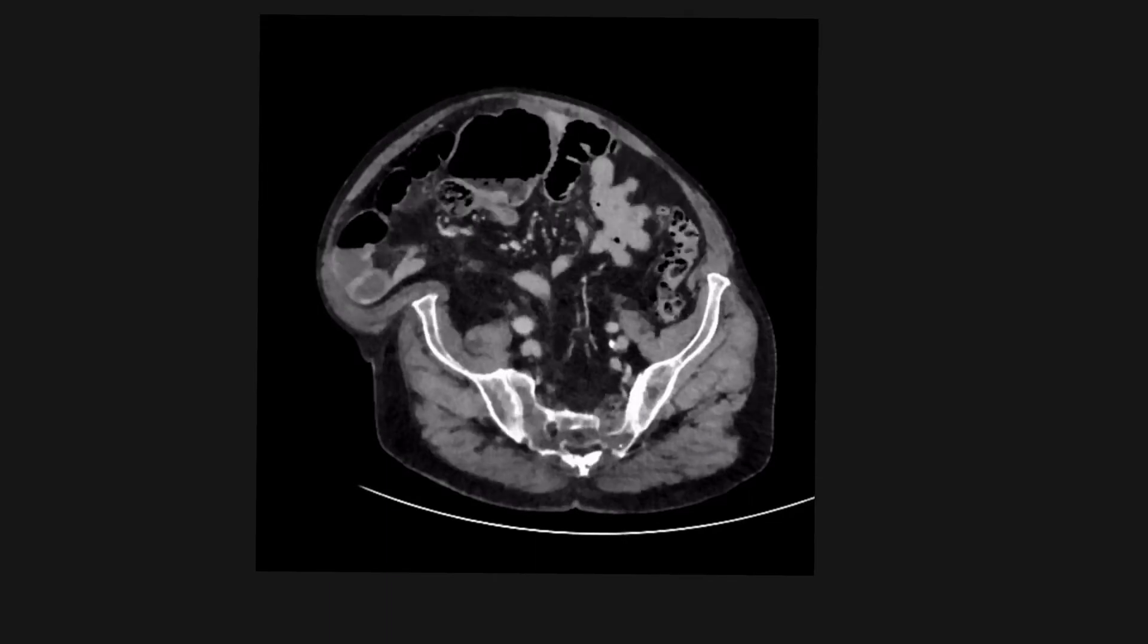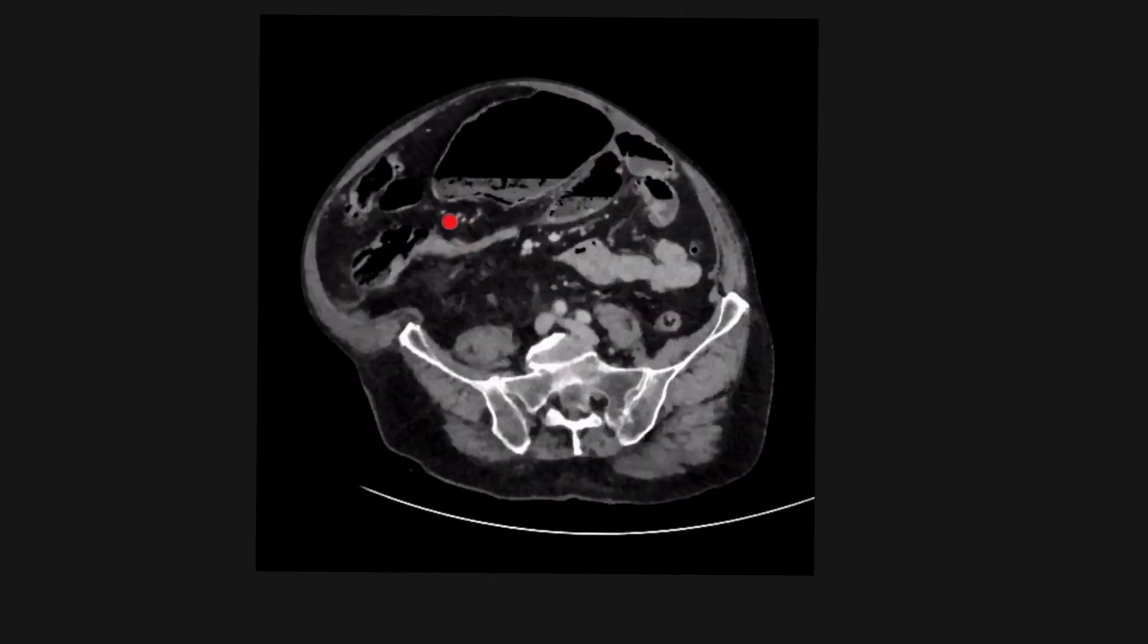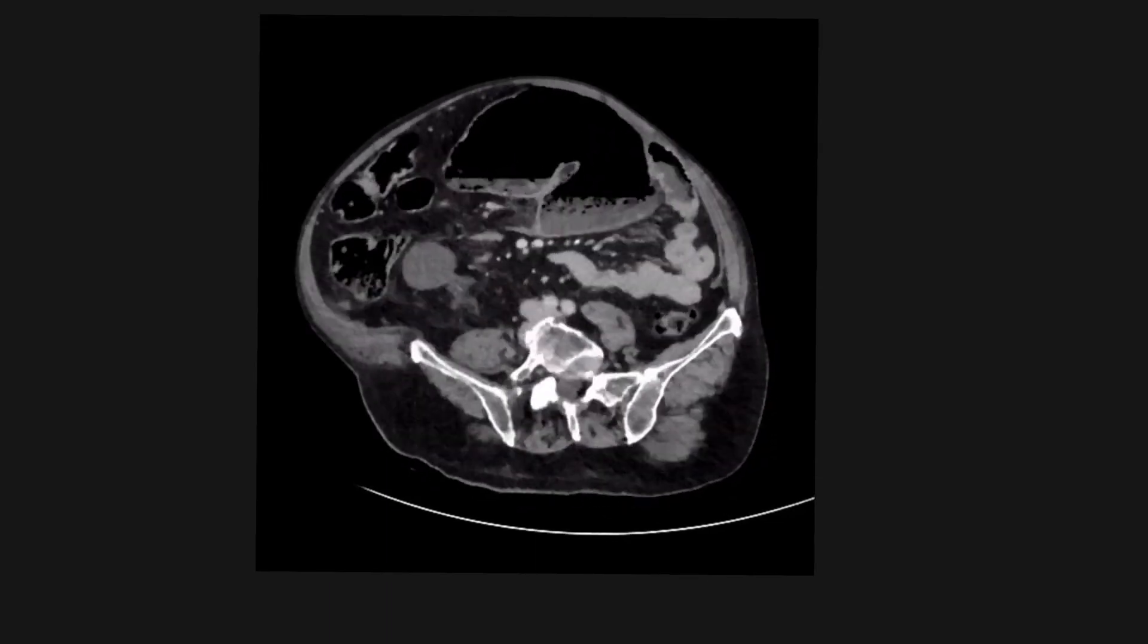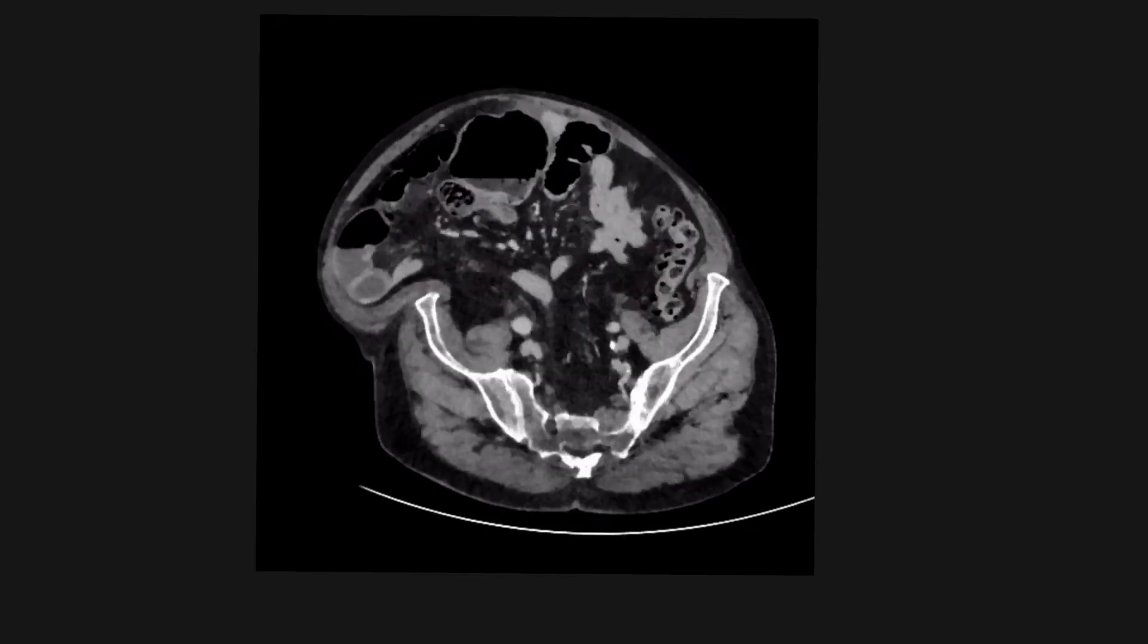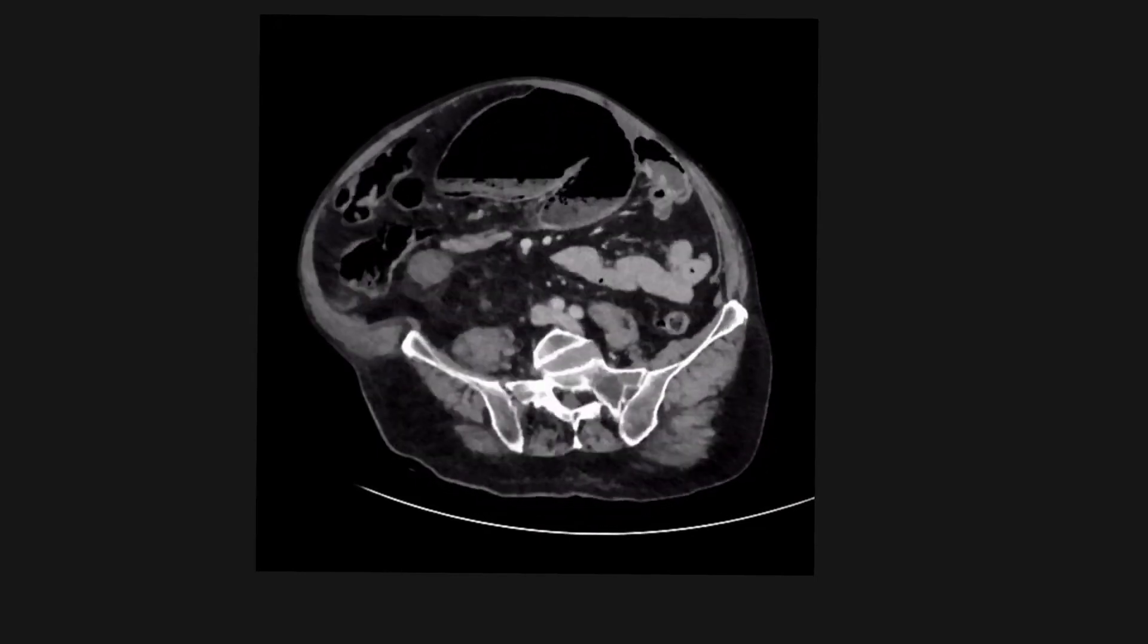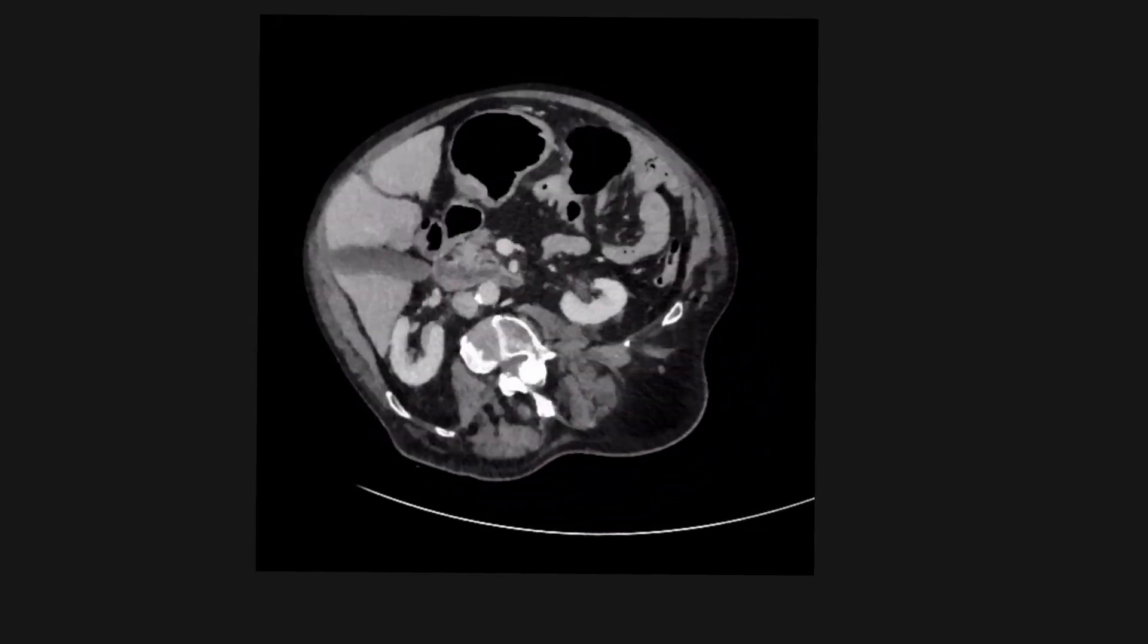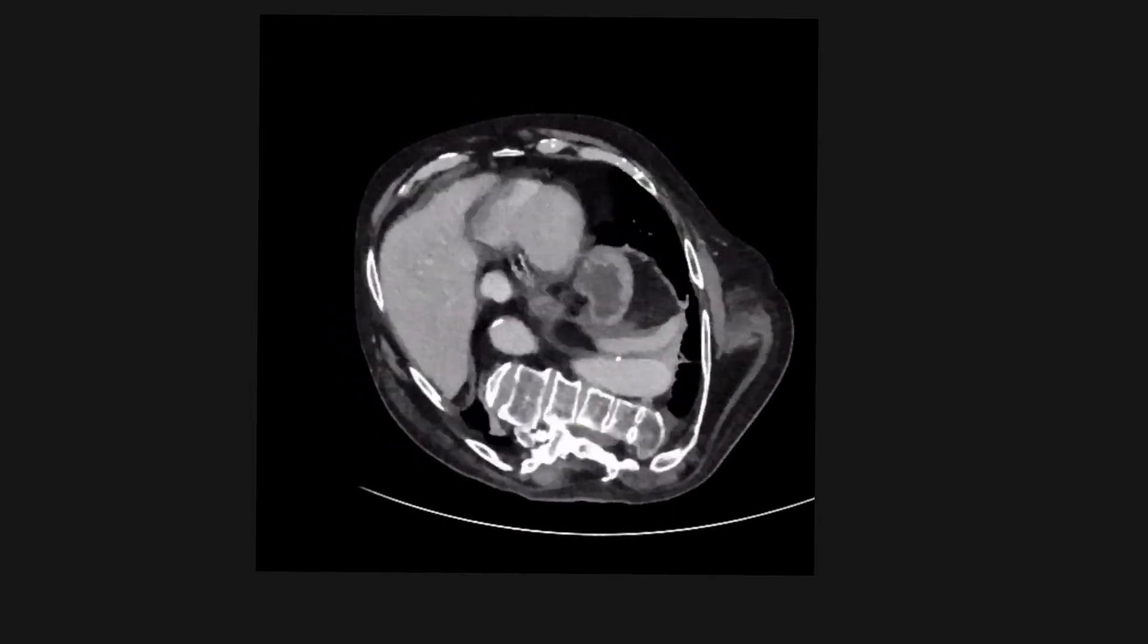We're looking for a twist, and there's the twist. And it's actually in the ascending colon, and there it is again. And this has led to twisting of the mesentery, which has led to dilatation of the cecum, and this is in keeping with a cecal volvulus.